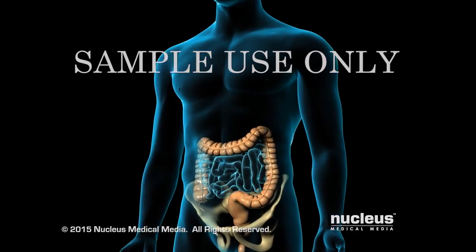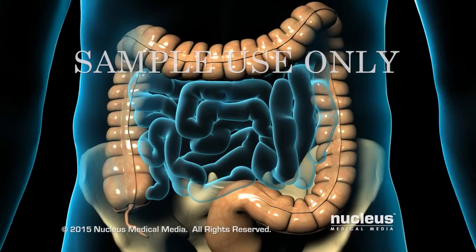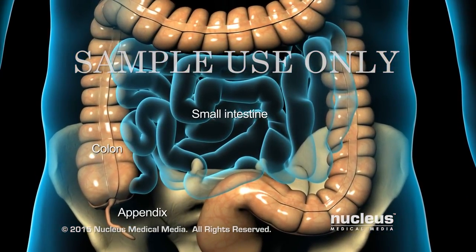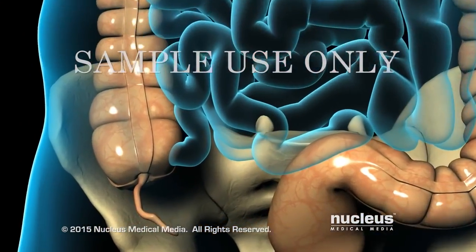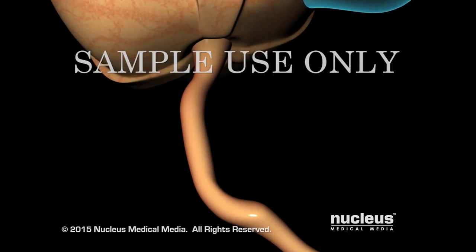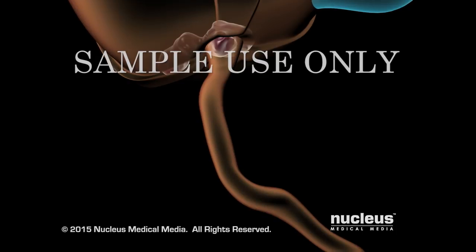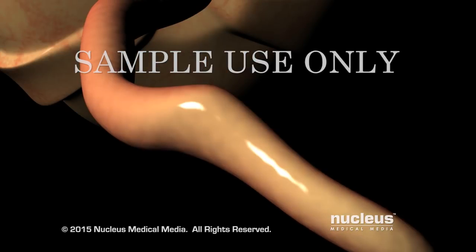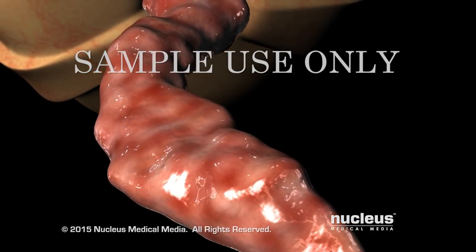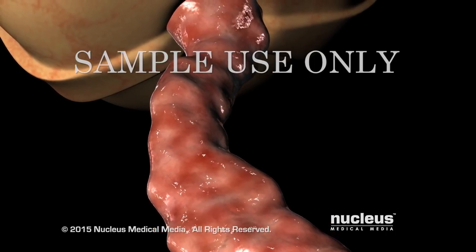Removal of the appendix, called appendectomy, is performed when appendicitis is suspected. Right lower abdominal pain, fever, and elevated white blood cell count are common symptoms and signs of appendicitis, which usually occurs when a blockage develops between the appendix and the intestine. This leads to infections, swelling, and distension. If the appendix is not removed, it can lead to a life-threatening perforation or rupture.